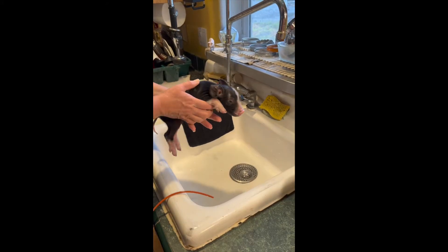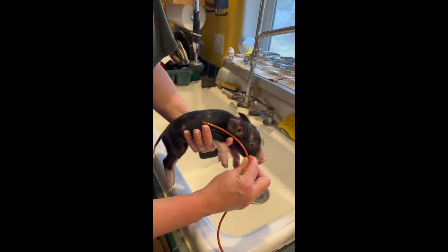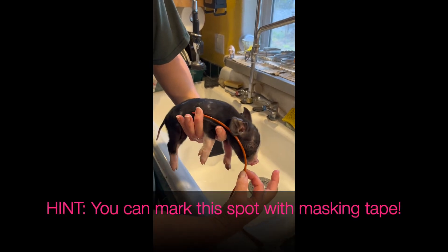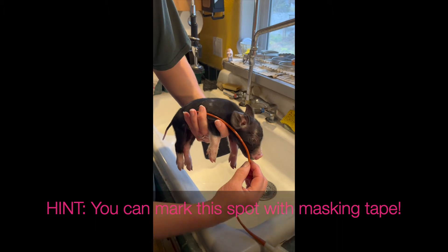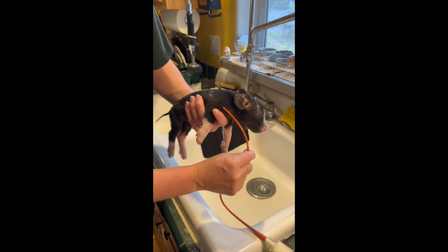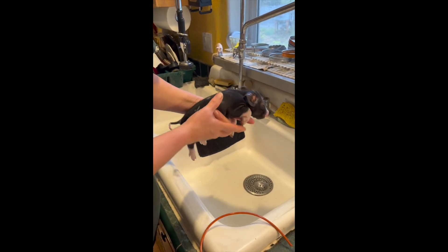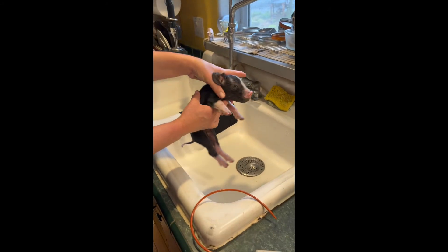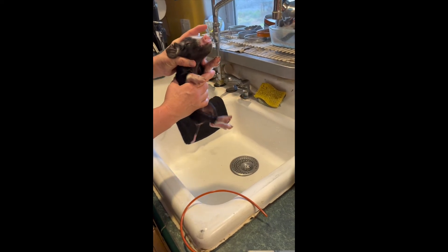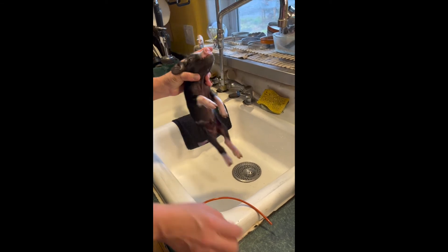You can see he's pretty weak. What we want to do is gauge the tube — about that far — that's about where the stomach is. We don't want to hit the lungs; we want it to go down into the stomach. If we only have it to here inside the piggy's throat, it'll be deposited in the throat and drown him. The way I do this is I cradle their head in my hand, which relaxes them and helps get this juncture open so the tube will pass where it needs to go.